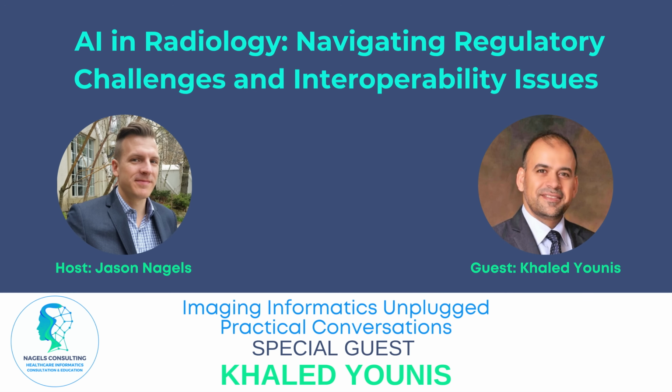The data, as I said, is one of the main aspects, but it is not the only one, because you also have algorithmic biases. This is the hidden problem. Just like we explained before, you can design the model with different architectures, and some are more susceptible to data change than others.